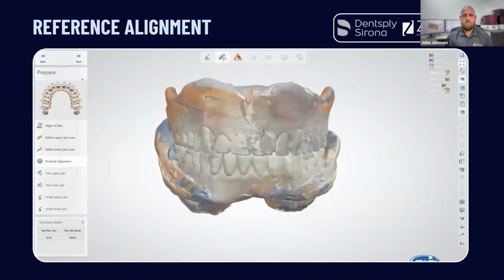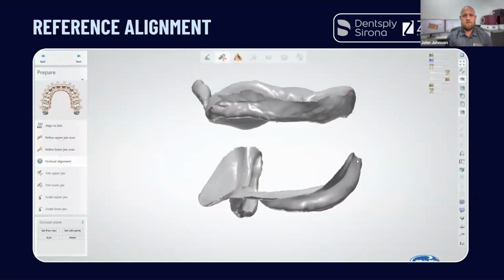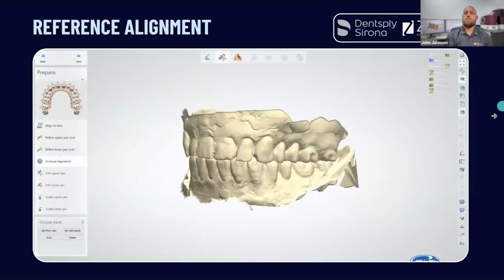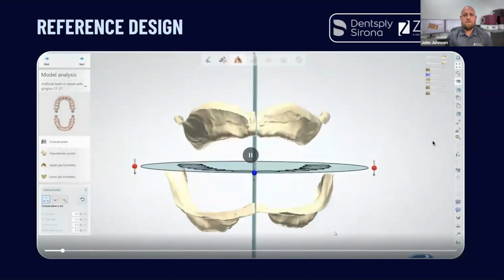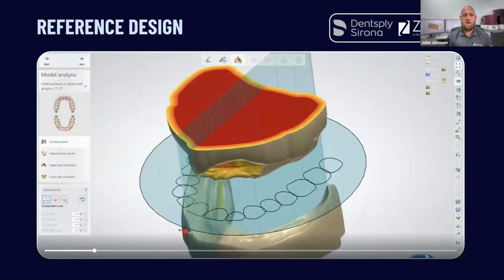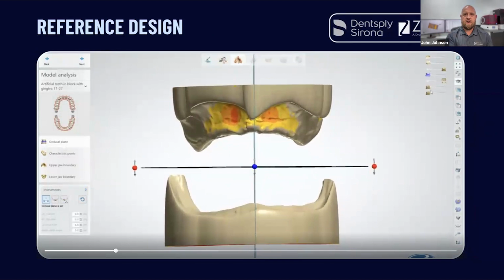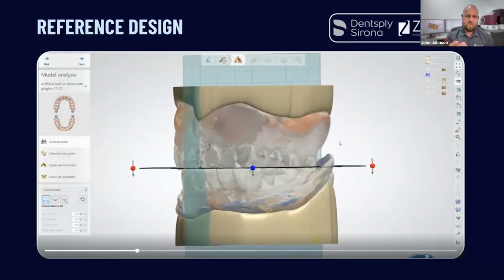So now from there, we've used the custom tray and we've used the bite, and now we have a new relationship with the upper and the lower. So from there, we're able to move on to designing our new denture. Within 3Shape, you have to tell it what you want to build off of. So you've got to get those two models oriented, and you've got to get to a point where those are your working models. Now those are my working models.